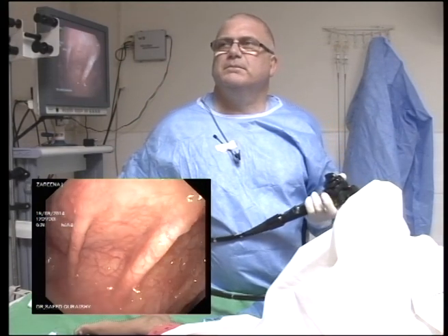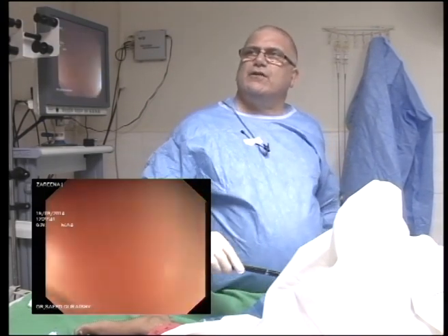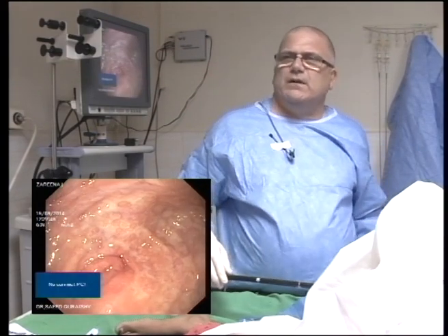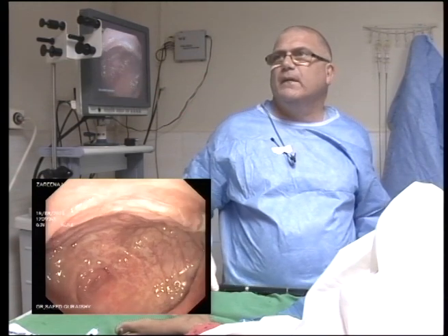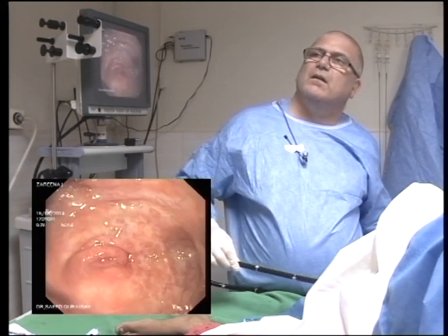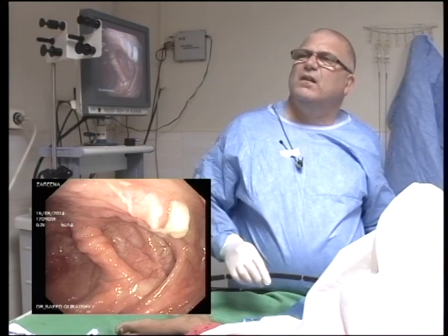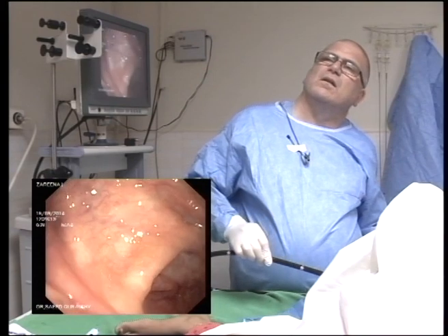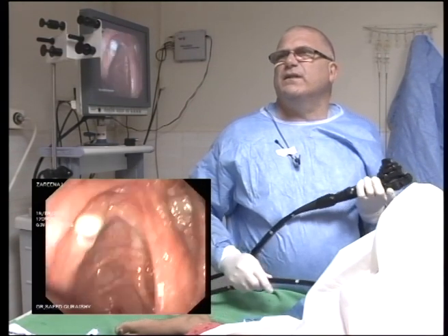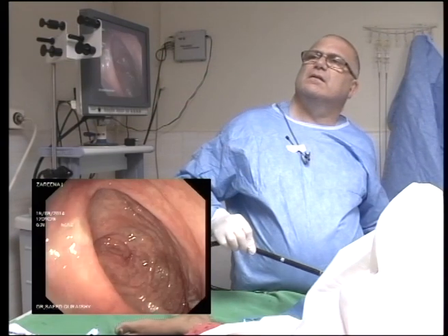I understand this lady had a resection of the bowel. What was the indication for it? Well, she had obstructive symptoms. Paul, she just had an ileostomy, no resection, I have been told. That's what Sajda tells me, because this is the patient that was just referred this morning. That still looks pretty abnormal. All I can think is it's probably an enterocolic anastomosis, if they've done a resection. What we have been told is just a simple ileostomy.